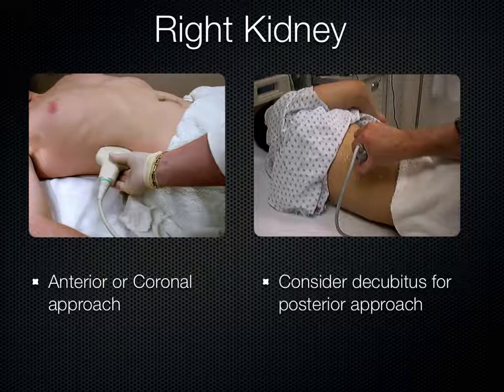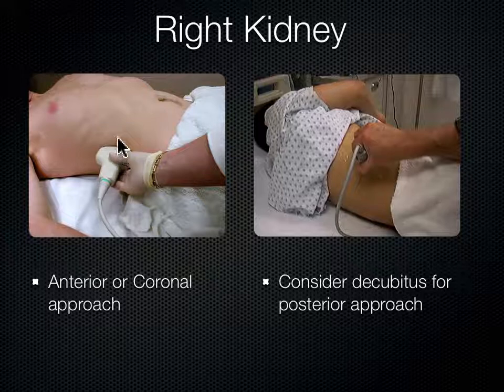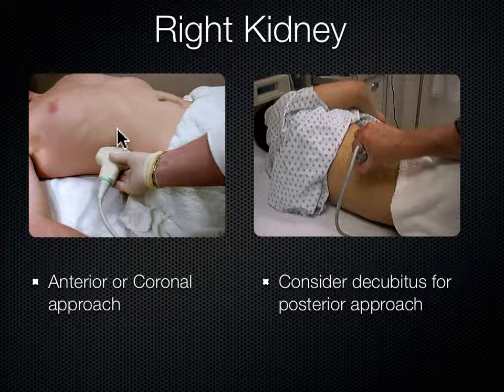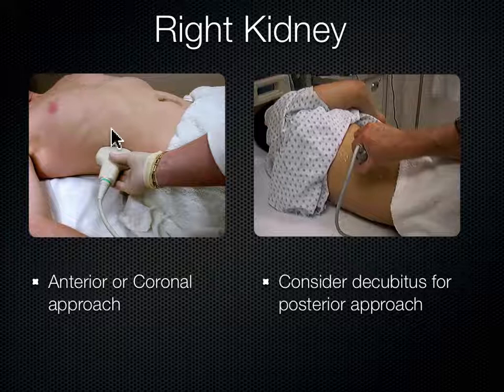There are a couple ways to look at the right kidney. You can come from the side of the body — a coronal approach — and sometimes get great views right away. Occasionally you need to drag the probe anteriorly, but since the kidneys are a posterior structure, compensate by fanning the probe posteriorly — tilting the cable toward the ceiling to shoot sound more posteriorly. Many times using the liver or spleen as your acoustic window in an anterior approach is actually better than a coronal view.